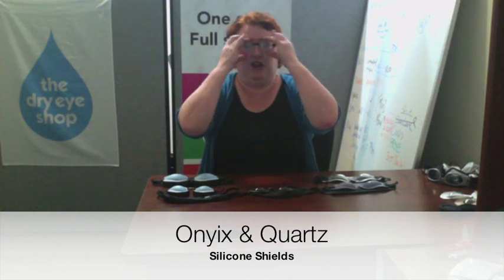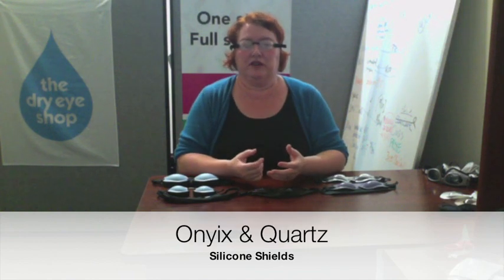I had a staffer here last year who was exactly the opposite. It kind of sat right on the bone, and on her, it looked more like a swimming goggle. It was right on the outside of it, so it vaulted way over her eyes. For me, it's fairly close to my eyes, but not so much that my lashes bang against it. I know there are ladies with larger orbits and long lashes where the lashes can be a problem, so it just really depends on fit. That's why trial and error is important. And by the way, we do have a 30-day return policy on all of these and really encourage people to experiment.